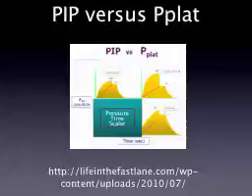And hopefully that makes sense: if the P-plat is a pressure in the alveoli, and the problem is with a plug in the endotracheal tube or bronchospasm or something along those lines, then it makes sense that the pressure in the alveoli is not going to be particularly high, because our problem isn't in the alveoli. So you can see the P-plat on the high RAW, or airway resistance. RAW is resistance in the airway. You can see the P-plat is much lower than the PIP. This is classic for an elevated airway resistance.